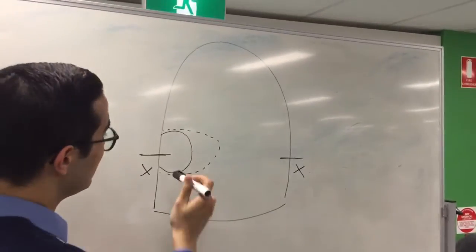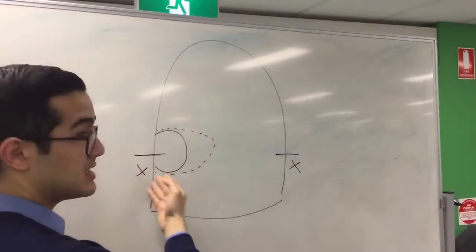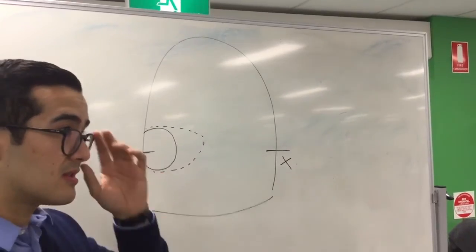So you want to be drilling in and then breaking through that interproximal wall. Now again, you do have to be mindful not to hit the tooth next door. So if you're unsure, you might want to use adjacent protection, like a matrix band, something like that.